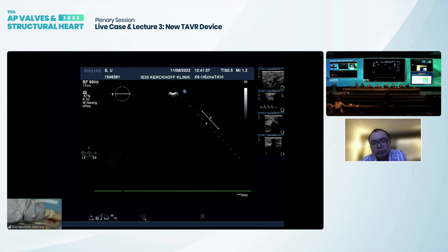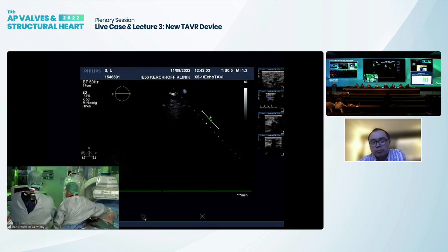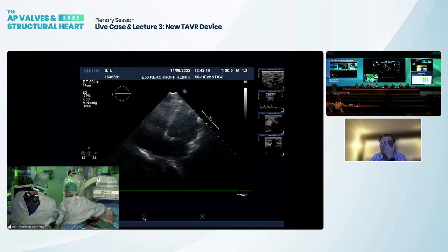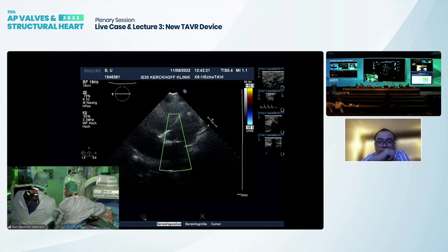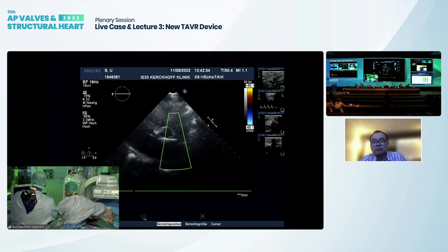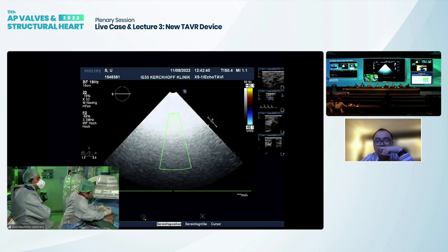But it might be difficult to see a good image because the patient, as I told you, is very skinny. And to be honest, the quality of the image in supine position is not so convincing. No, not really. We could only see major leaks, which we wouldn't expect anyway. So you can see that the image quality is limited here. I will try to obtain a parasternal view.